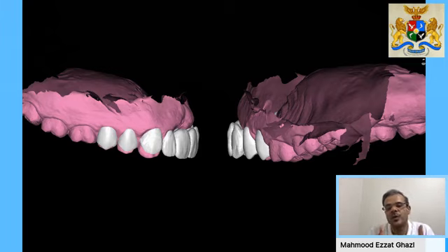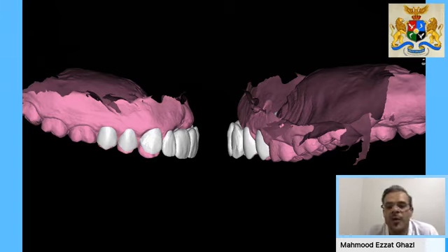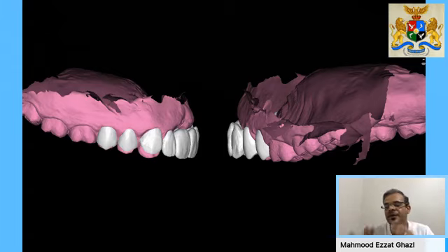So we didn't only have a deficiency in vertical bone, we also had a horizontal bone defect. So we really needed to regenerate that area and to bring the bone at a higher level than the patient's upper lip. So it's a totally different way of thinking.